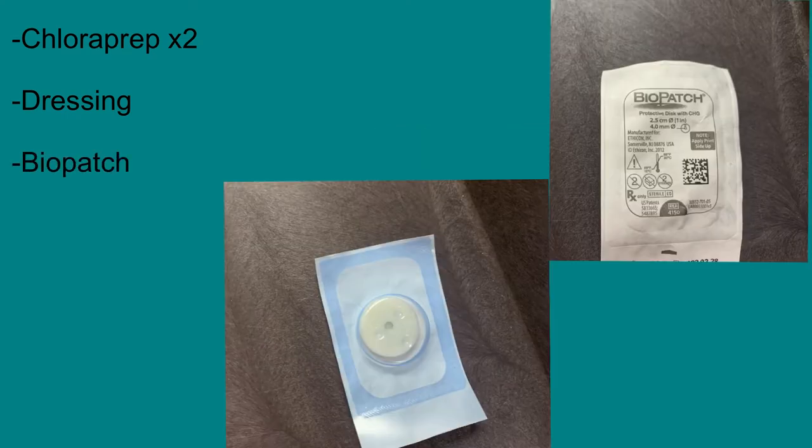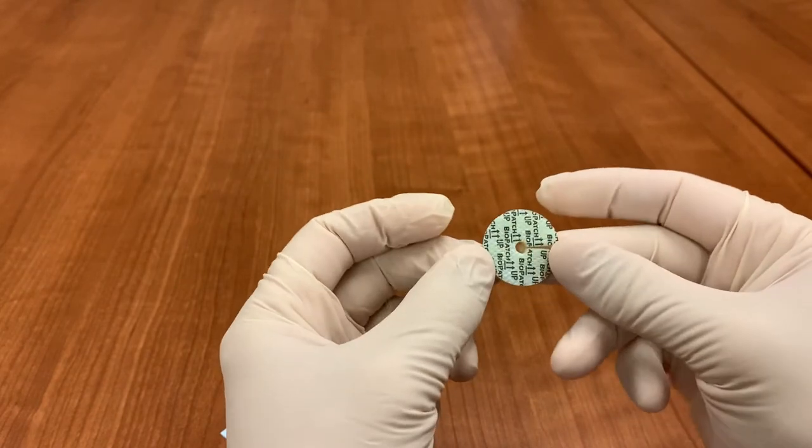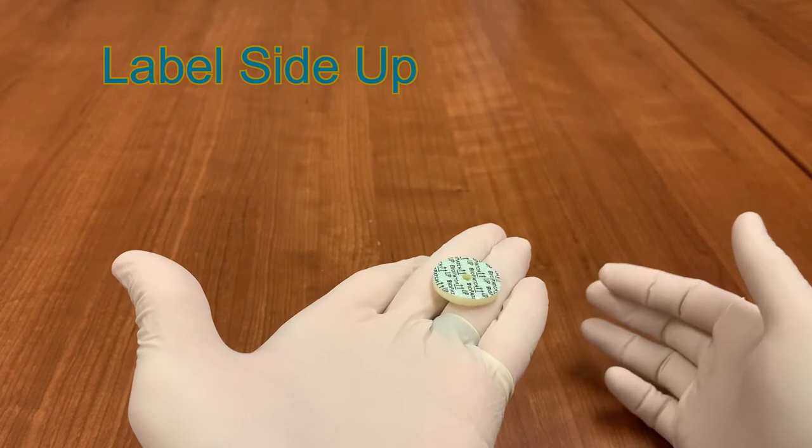Biopatch is a small disc impregnated with chlorhexidine. It has a foam side and a blue labeled side. The labeled side should always be visible or facing up. The foam should be in contact with the skin to allow the chlorhexidine to continually disinfect the catheter site.